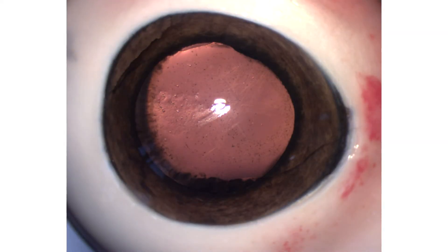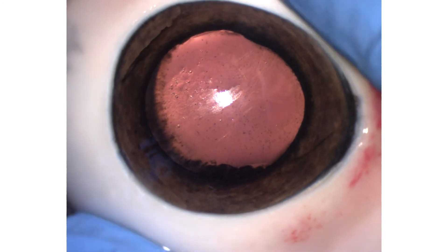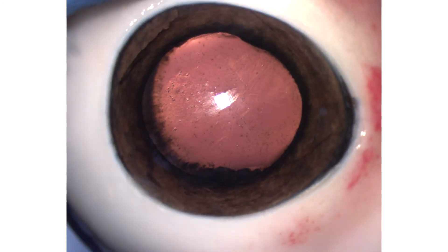The eye is already prepared. It's already under infusion just to get a little bit harder eye. So the pig eye is also ready for the treatment.